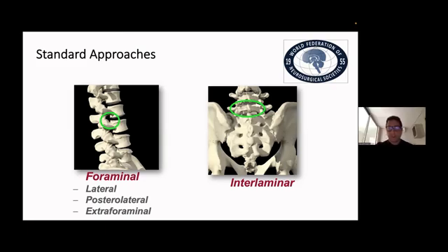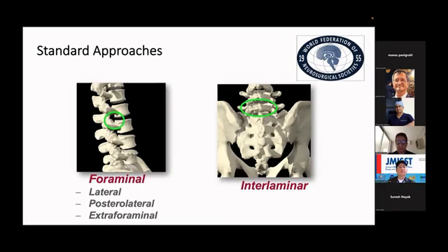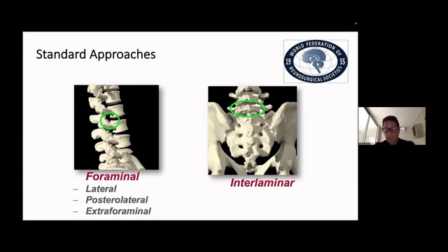So let's move on to talking about the standard approaches. There are two accesses to the spine using an endoscope. The first one is the foraminal approach, and the second one is the interlaminar approach. Depending on the size of the foramen and the location of the herniation, you can select the most indicated approach. For example, the lateral, the posterolateral, and extraforaminal for the foraminal approaches, and the interlaminar one.